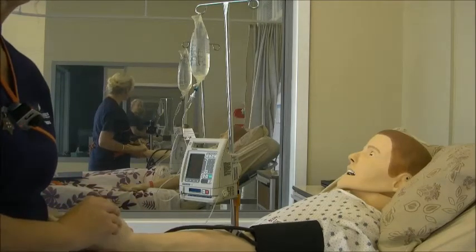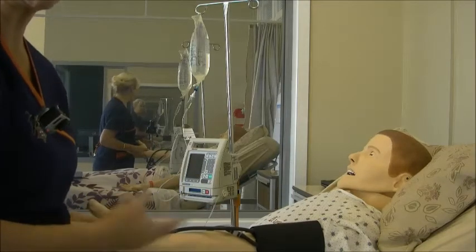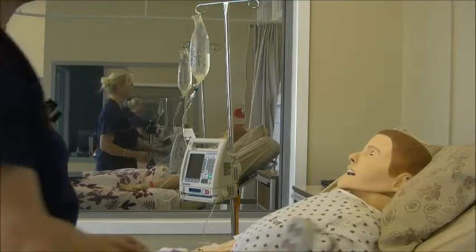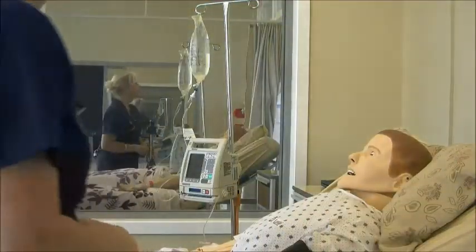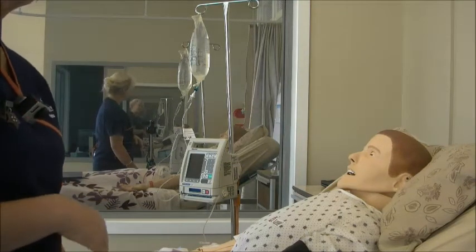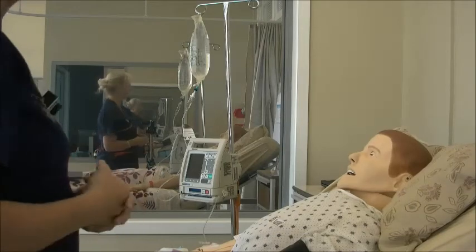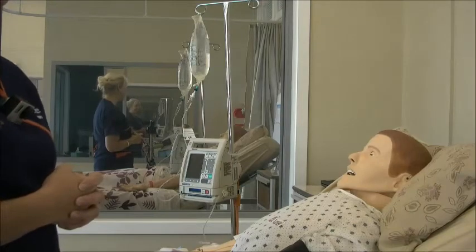I'll then ask the tutor what they thought his cap refill time was, and hopefully it's less than 3. So she's going to tell me that it's 2. So I'm happy with that. The next thing I want to do, I may check his blood pressure again. It might be appropriate in this case to do that because we've started some IV fluids, and I'm hoping that his blood pressure is a little bit better.